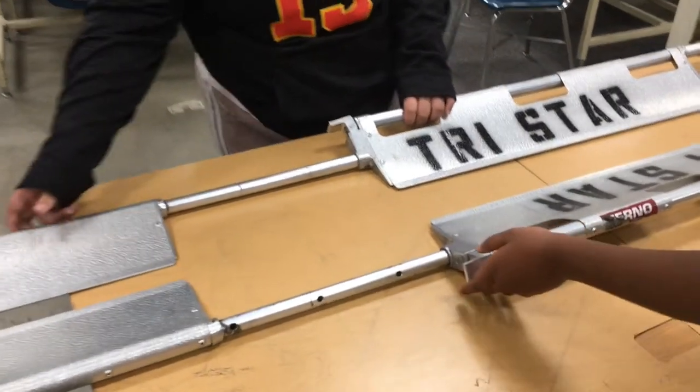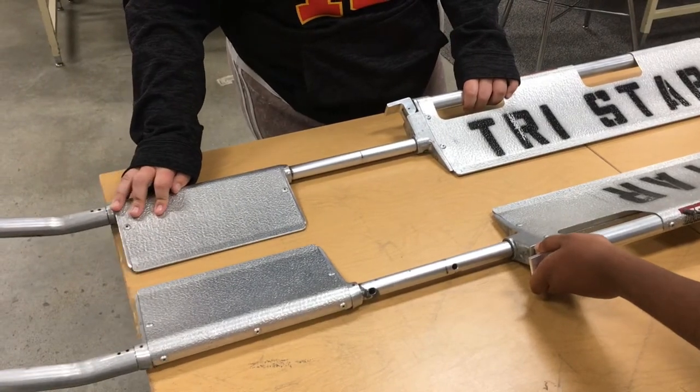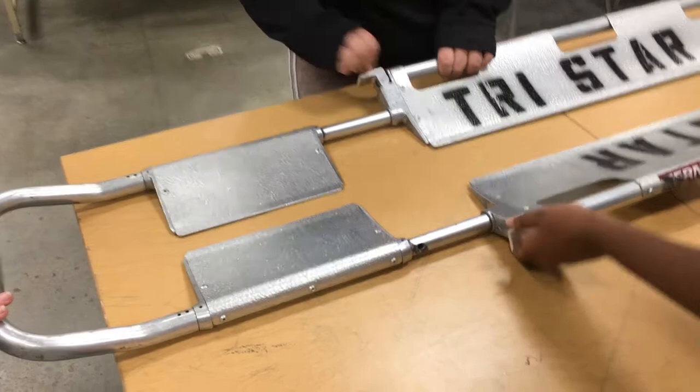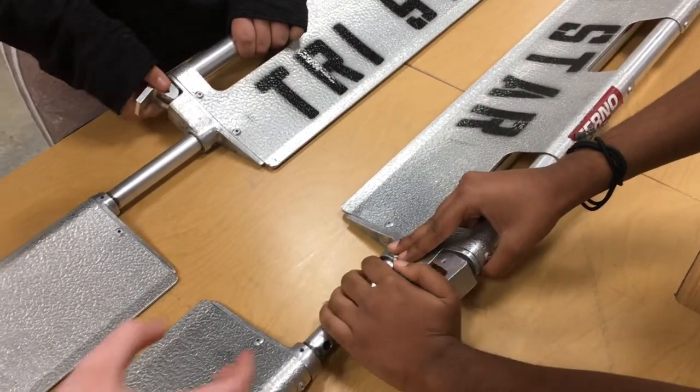The first step in using the scoop stretcher is to adjust the stretcher length to the patient by turning the lock pegs. After you slide it to the required length, you want to lock them in place.